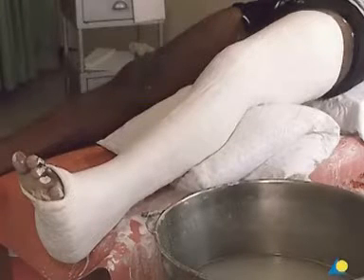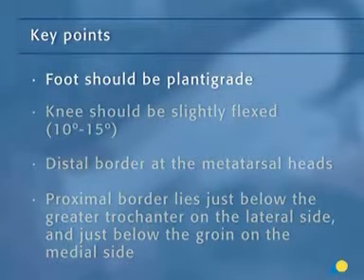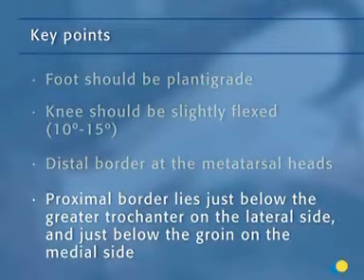The upper leg circular cast is not initially intended to be a weight-bearing cast, so the patient will need to use crutches, and a foot pad has not been used. To allow for weight-bearing, the plaster can be augmented later with a walking rubber, which will take weight when walking or standing. The foot should be plantigrade and the patient's knee should be slightly flexed, 10 to 15 degrees. The distal border of the cast is located at the metatarsal heads. The proximal border lies just below the greater trochanter on the lateral side and just below the groin on the medial side.